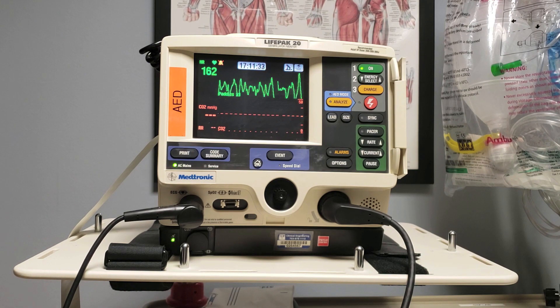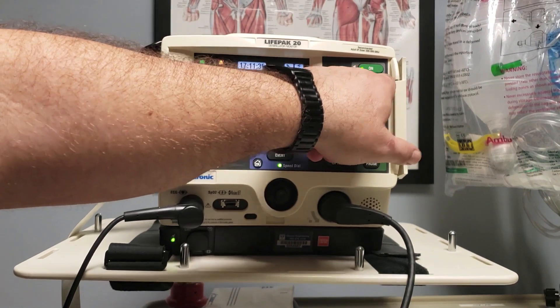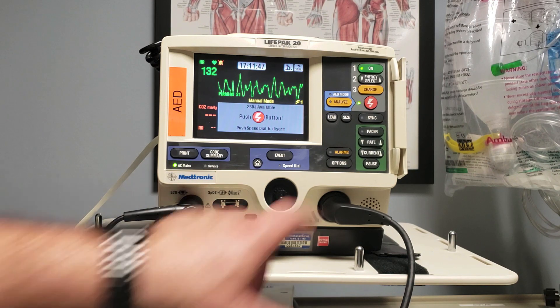We've completed a cycle and it's time to shock again. Charging up to 250 joules. Charging. I'm clear, you're clear, we're all clear.